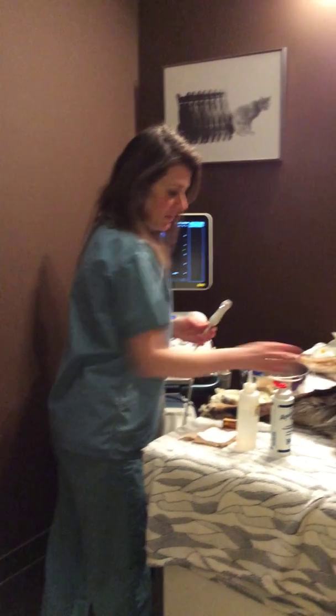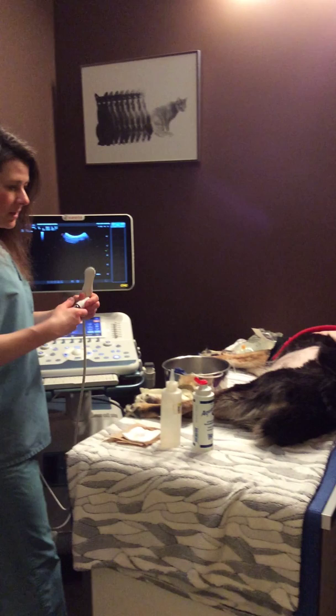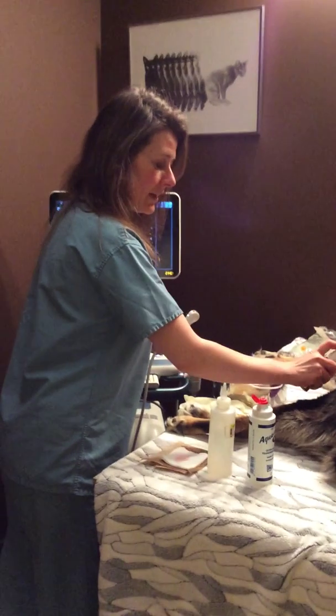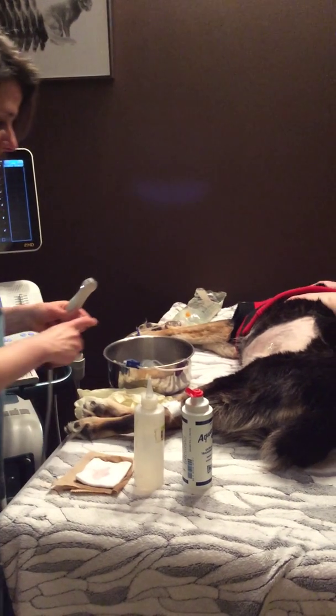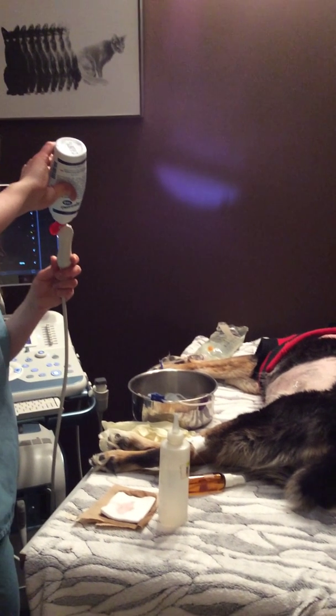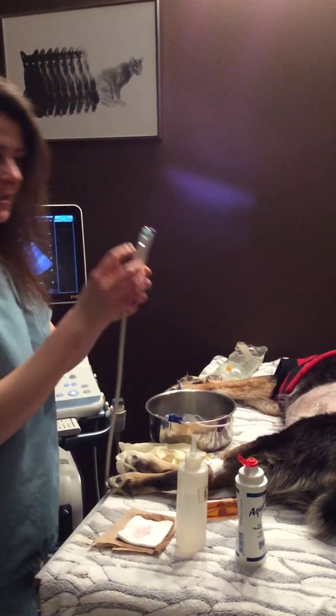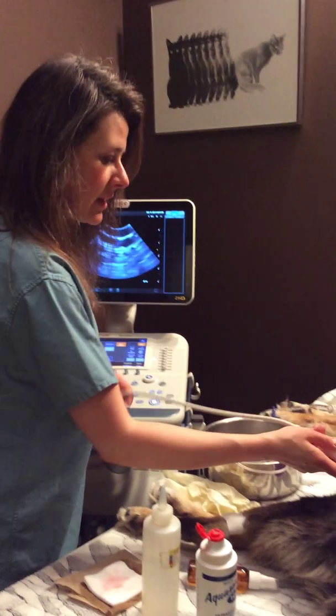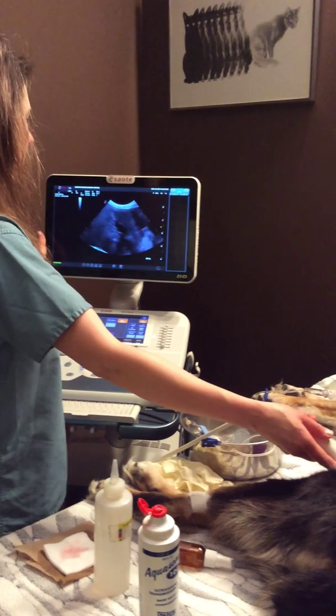And this is Clio. Basically what we do for an ultrasound is we put a small amount of diluted water — I put a little essential oil in it too, to help make it smell good and help chill her out. Then I apply some gel to our ultrasound probe. It has a little white light that shows where the front part of the study is, and we just put the probe right on the belly.